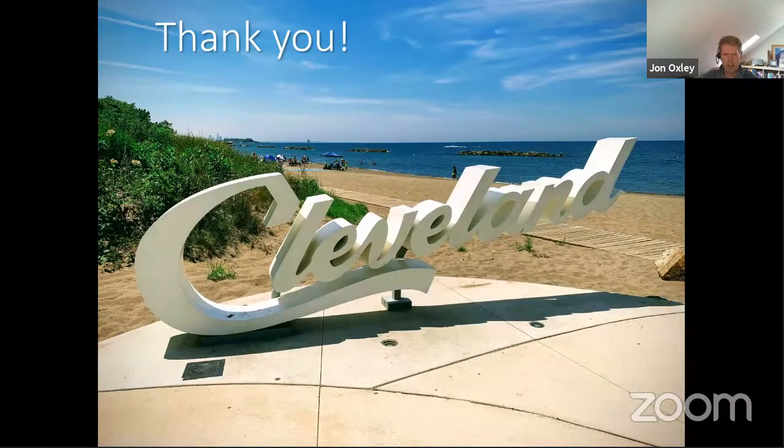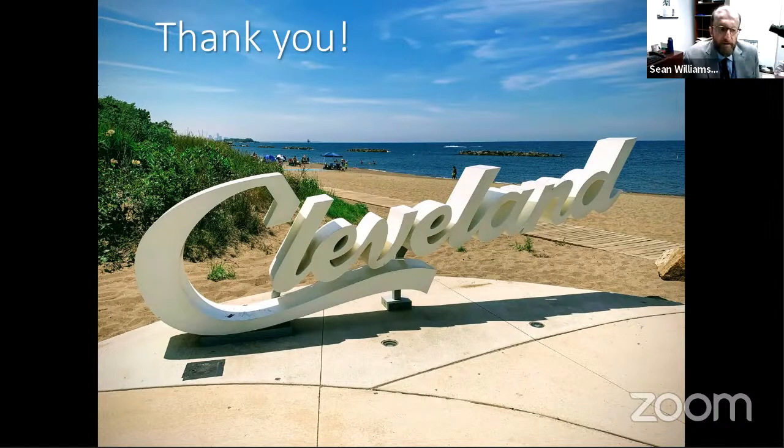We're coming to the end of our allotted time, but there's one more. How frequently have you seen renal vein invasion by clear cell papillary renal cell carcinoma? I think I've only seen that once. A colleague of mine shared a consultation case, and really everything looked like a clear cell papillary renal cell carcinoma, except it had renal sinus and renal vein invasion. So I think I've seen that only once.